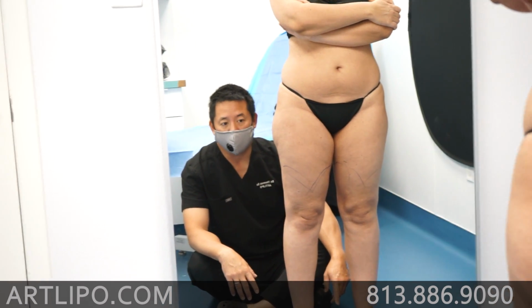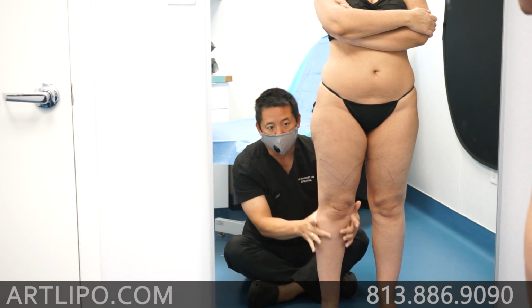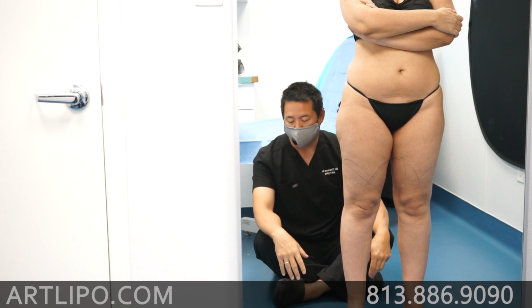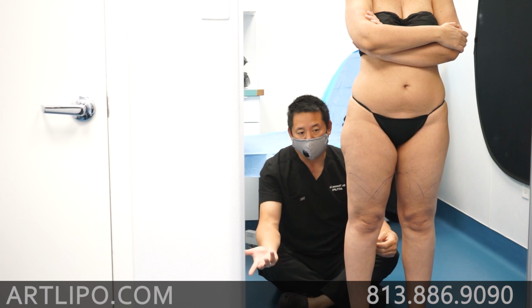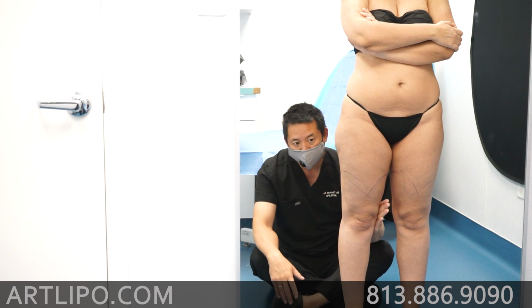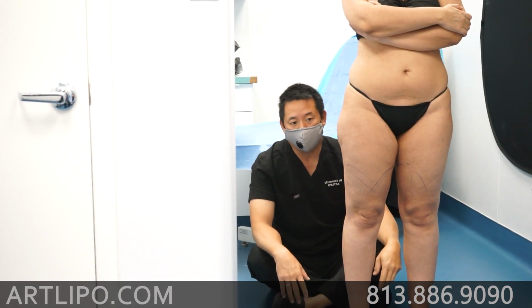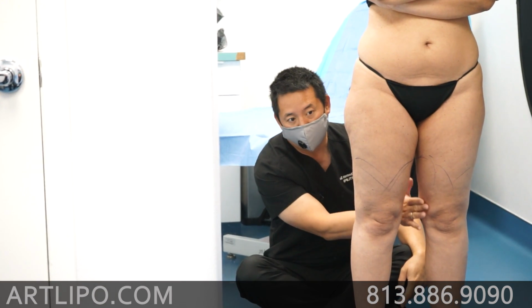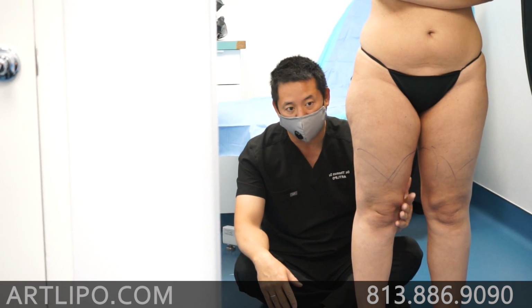And I call this the knee complex, which is this area, circumferential or a Lipo 360 from here up to here. And compared to what doctors call knee liposuction, traditionally, all doctors doing lipo do the knee, but they do this little area, this little bulge right here. And by the way, my volunteer Mary here has had knee lipo before, and you can see that the doctor did a little bit and left this little dip right here, did some already right here, but there's still a lot of fat coming through all this area.